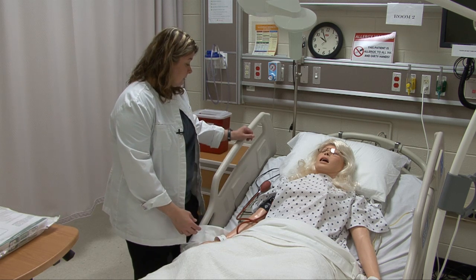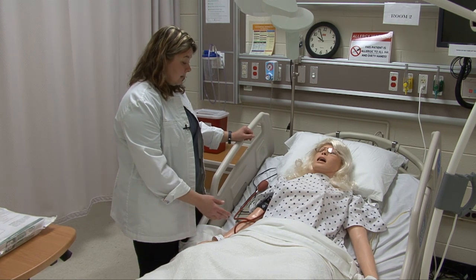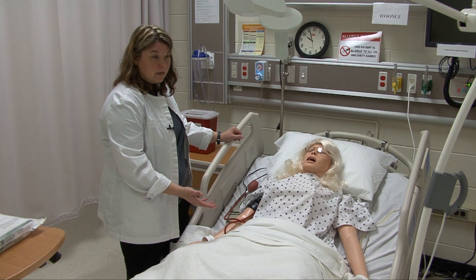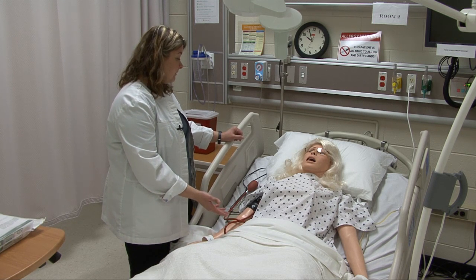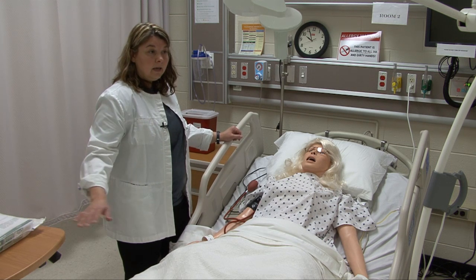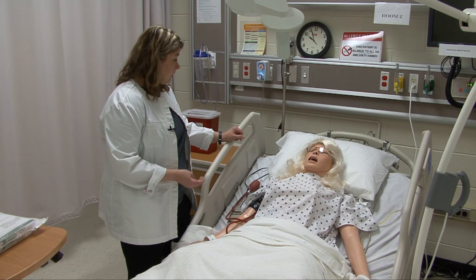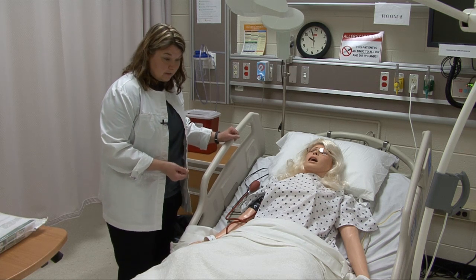Mrs. Smith, as I said, my name's Heather, I'm your nurse today. I'm here to do the catheterization. As we talked about earlier, it seems like you're having what we call urinary retention — we pressed on your belly, you said you haven't urinated in a while, and we did a bladder scan. We've determined the reason for the catheterization and explained it to her. We're going to ask her if she has any allergies — especially to latex or betadine, since the catheter usually has latex and you clean with betadine during the procedure. She says she has no allergies, so we proceed. We've performed acknowledge, introduce, duration, explanation, asked about allergies, and identified the patient.